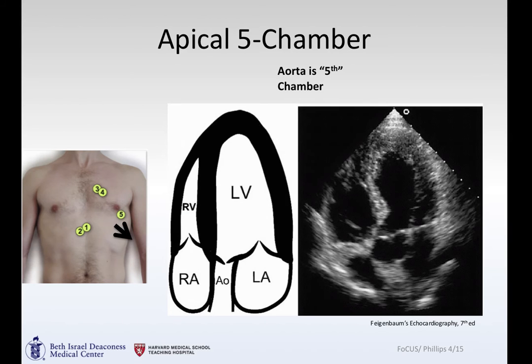Turning the probe from the axilla down towards the bed, you can open up the fifth chamber of the heart, which is the aorta. So here's the left ventricle, aorta, aortic valve, left atrium, right ventricle, and right atrium — and here is a cartoon of it.